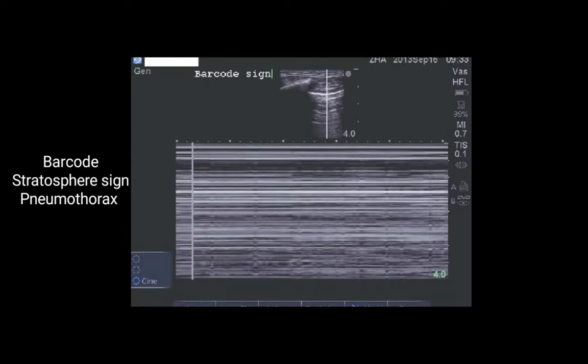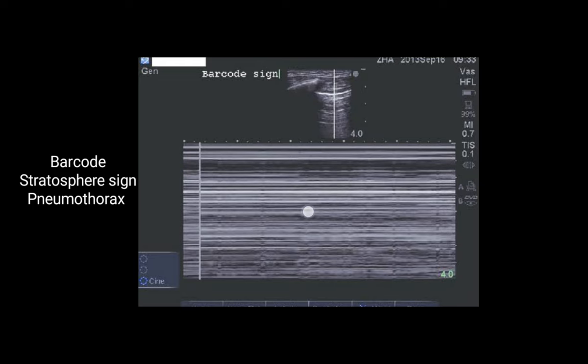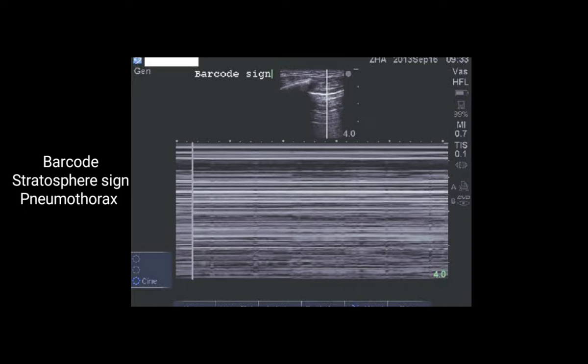The next image shows the barcode sign or stratosphere sign, which is seen in pneumothorax. In the normal lung we have the seashore sign, but in pneumothorax there will be only lines with no granular appearance.